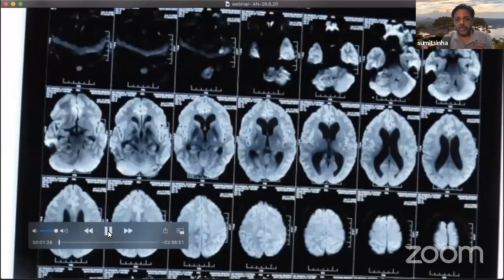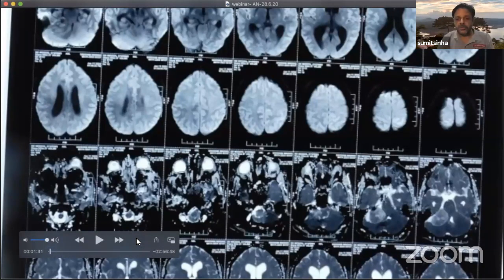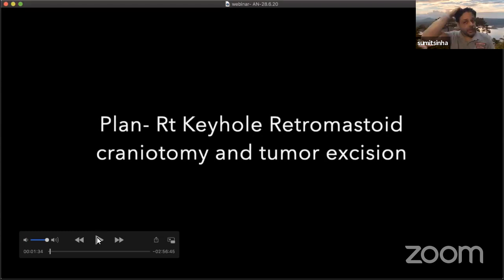And this is the diffusion weighted image. The importance of a diffusion weighted image is to show you the consistency of the tumor, how solid or cystic the tumor is, and also the changes in the brainstem or the cerebellar area. If the diffusion weighted changes are present, then this is not a good thing to have actually. So this is about the MRI, as to what you will look for in the patient's MRI.